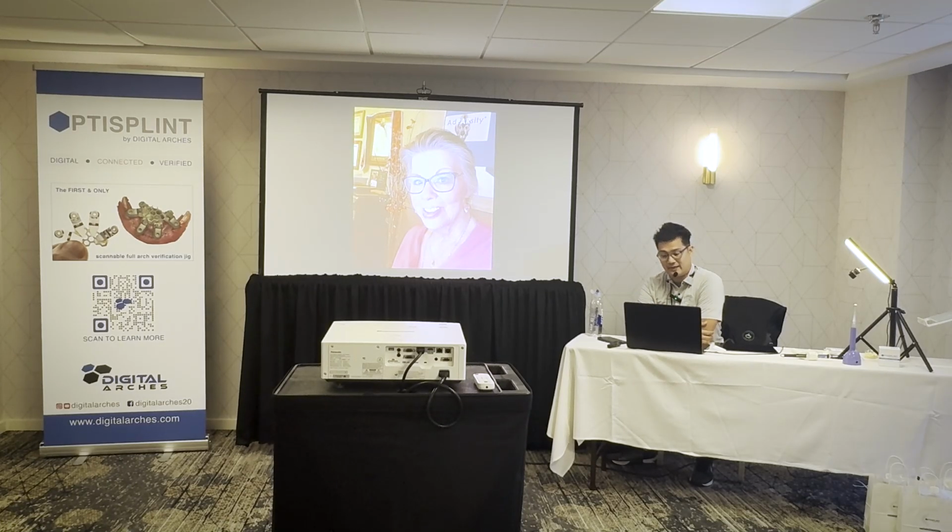I did present to an oral surgery office in LA, and it's 7 surgeons with an in-house oral maxillofacial prosthetist. They do 200 arches a month, and they're doing their final zirconia within the same week. I asked him, how often are you remaking an upper maxillary prosthesis because of tissue recession? He says that when they build the final, they add an additional 2.5 millimeters on the intaglio rail, and they found that less than 1% of cases require a remake.